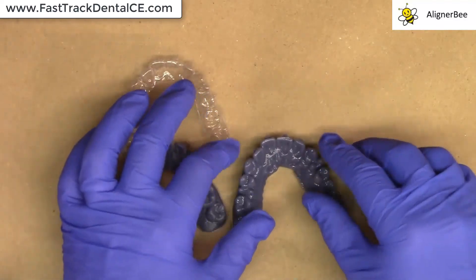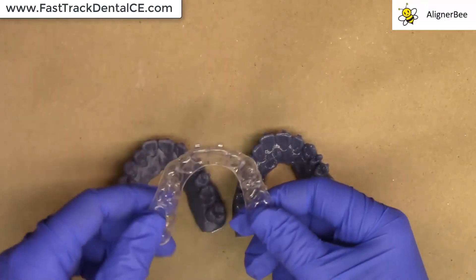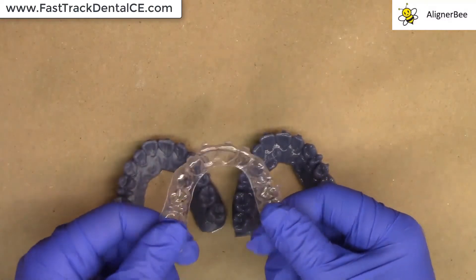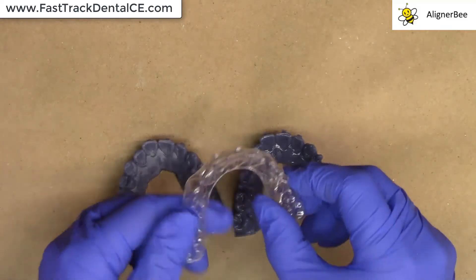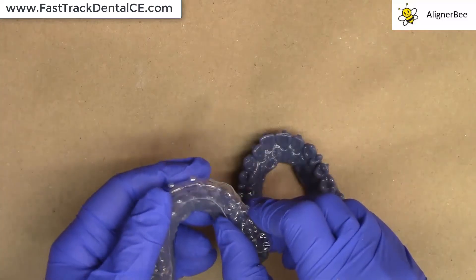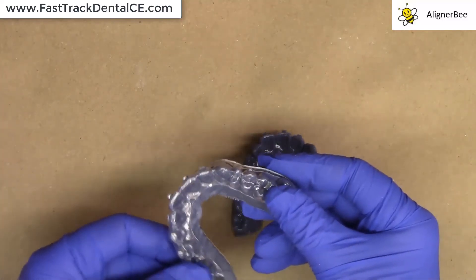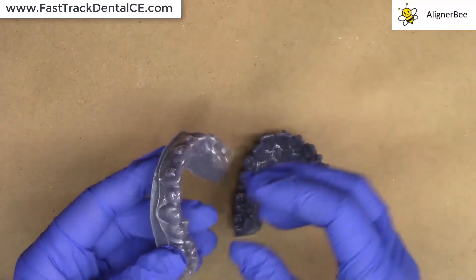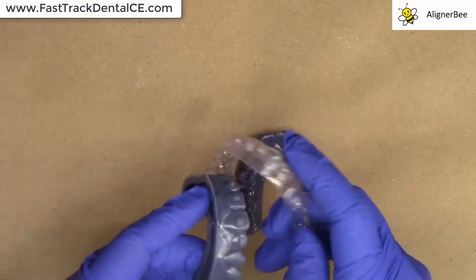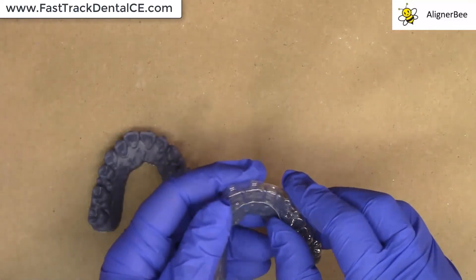In order to check and verify that there were no changes when I re-exported the patient's models, I fabricated an Essex-style retainer out of a very thick and durable material. I formed the vacuum form on the horizontally printed model and trimmed, and then to verify that I would have the same fit on my new vertical printed models, I tried the retainer onto the new vertical print.